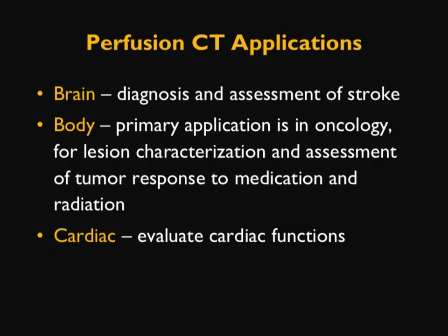What are some of the CT perfusion applications? One of the main primary applications which has been now established is in brain. Diagnosis and assessment of stroke has been one of the key niche applications of CT perfusion from the time CT perfusion became viable on the modern scanner.